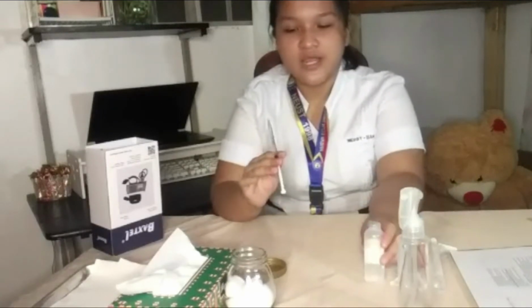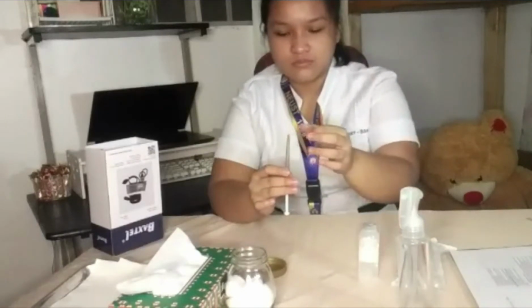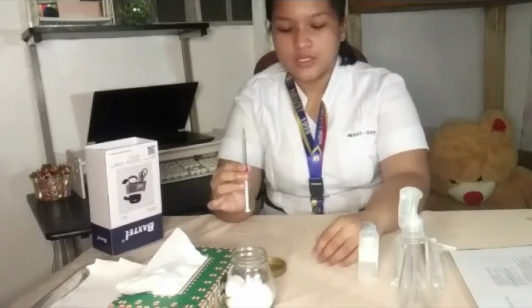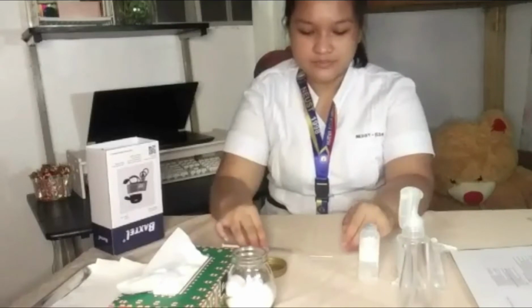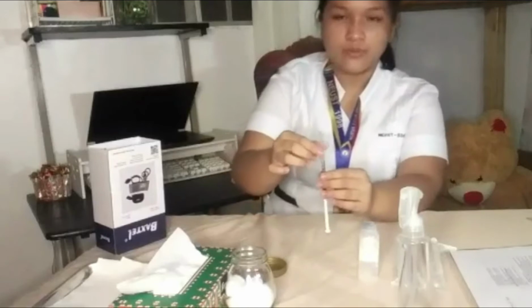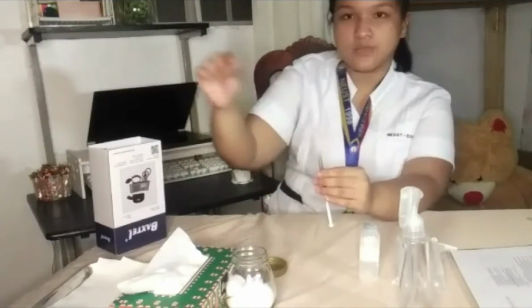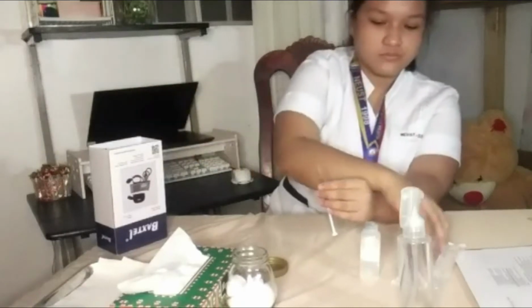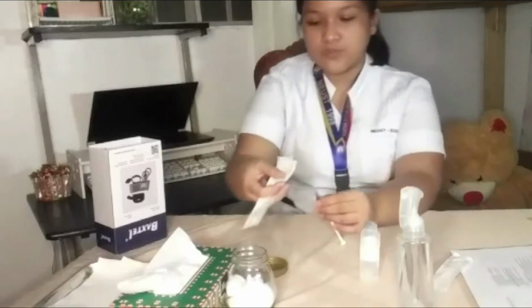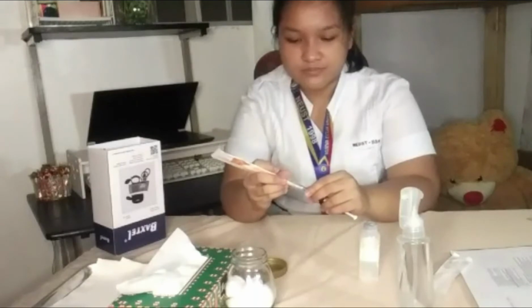After I get the desired medicine for my patient, I am going to put the cap back on the aspirating needle. Remove the needle by twisting it and discarding it in the sharps bin. And now I am going to put on the needle that I am going to use for my patient.